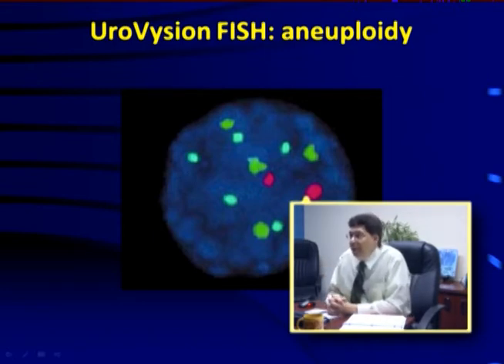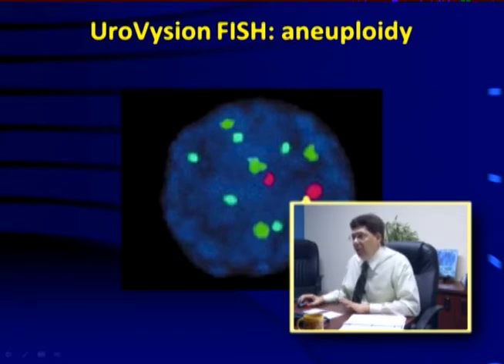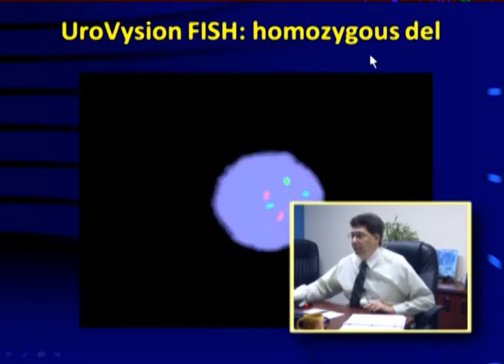And so you may see 30 or 50 or 70 or even 100 cells that we've counted, because again, FDA scoring criteria requires that we scan everything that's on that slide and not just stop after 25, even if we've got 4, 5, or 6 abnormal cells already. So the N is never going to be the same, but the criteria for abnormality is consistent. 4 out of a minimum of 25 cells that are aneuploid, and it's considered abnormal.